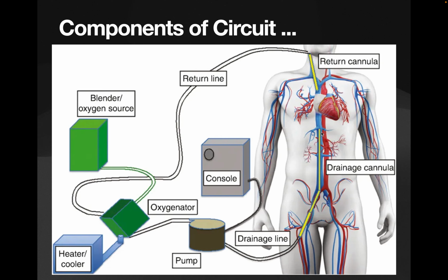So this is a drainage cannula which sits in the area where the distal tip is just proximal to the hepatic vein in the IVC, just before the right atrium, and it is guided by a transesophageal echocardiography, which is done intra-procedure.